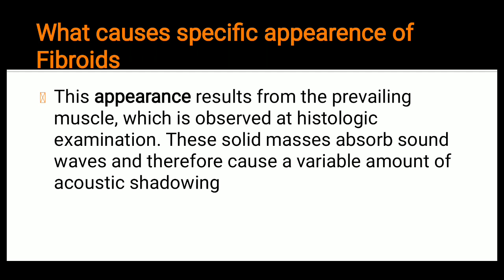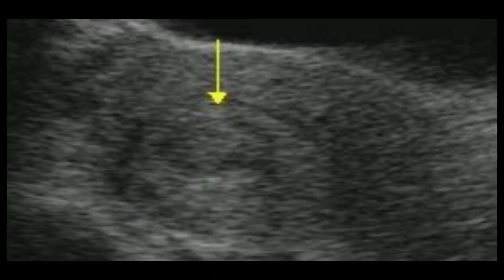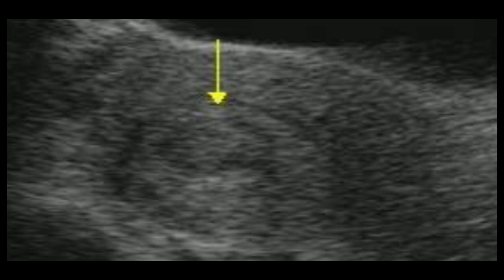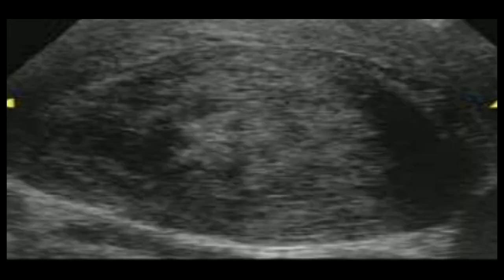If we do the histological examination of a hysterectomized uterus, that will give us the confirmatory report. Because of those prevailing muscle bundles, we see the specific appearance. These solid masses absorb sound waves and therefore cause a variable amount of acoustic shadowing. You can see the concentric solid as well as the hypoechoic masses in this ultrasound.